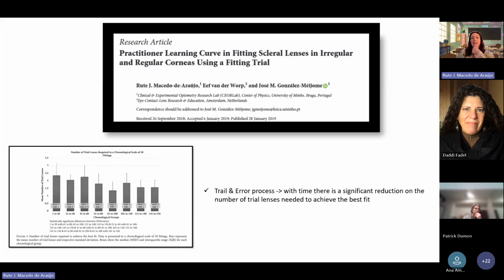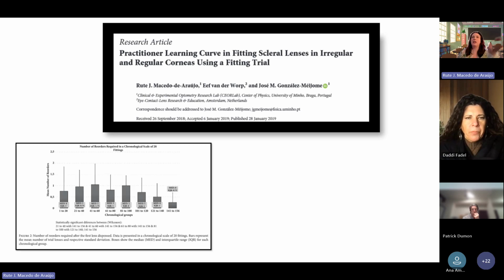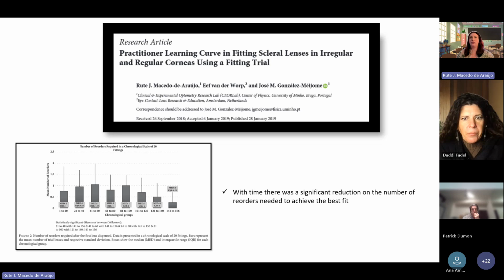And in this study, this is also a study from my PhD. When we fit scleral lenses by a trial and error process without advanced technology, in the great majority of cases in the beginning, we will need 2 trial lenses to achieve the best fit, in some cases more, of course. But with time, we will reduce this number of trial lenses and this chair time when we gain more experience, and the same for the reorders to the manufacturer.